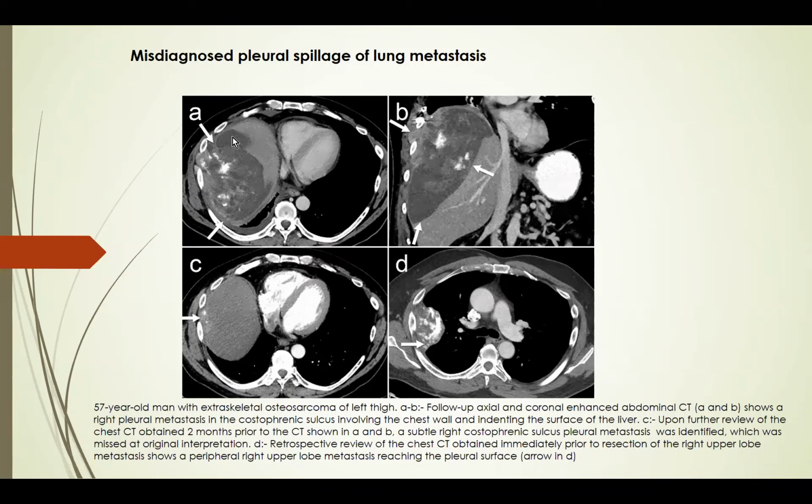But at this point, the primary tumor was resected and the lung metastasis was resected. This was the only site of disease at that point. So this patient underwent hepatic arterial chemo infusion because it was read as a liver metastasis, for 2 cycles. Even the IR note mentioned that there was no blush, but we still went ahead and gave it.